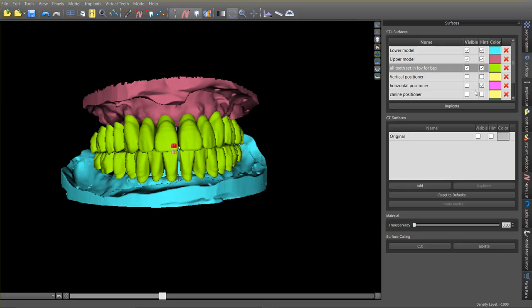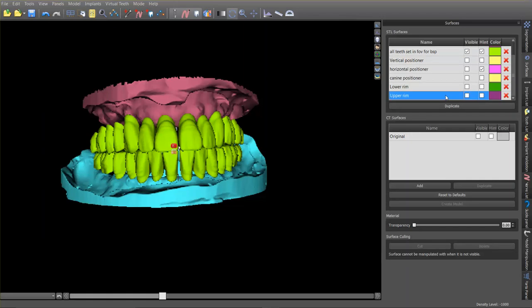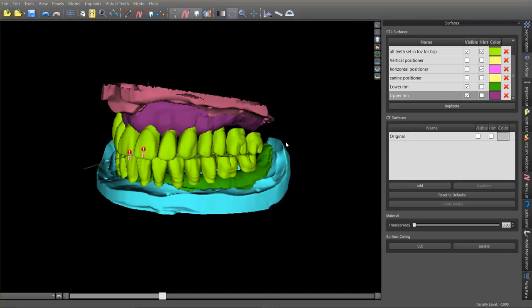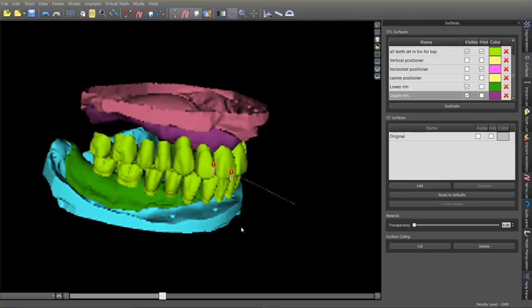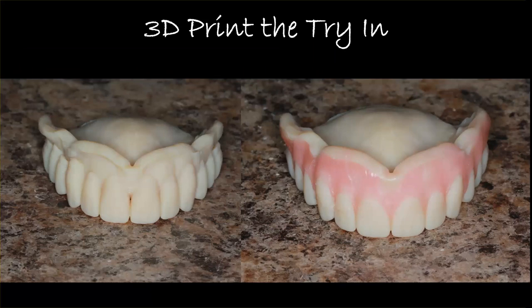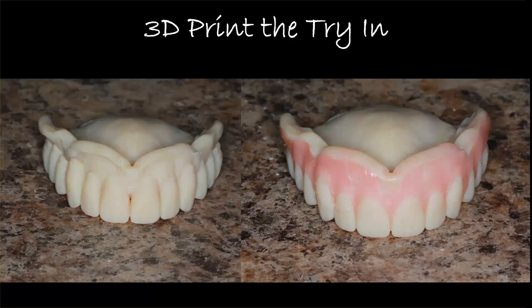We've got the right size teeth positioned correctly in space, and now we need to make the bases for them. This is already functional in Blue Sky Plan — you simply make a so-called surgical guide on each of these models, press Create Guide, and there are your bases. You export these and 3D print the try-in. The base is anatomic — the inside fits exactly to the cast. It's not like a traditional wax try-in where they had to block out undercuts; this engages everything so you know exactly how well the denture is going to fit at the initial try-in.